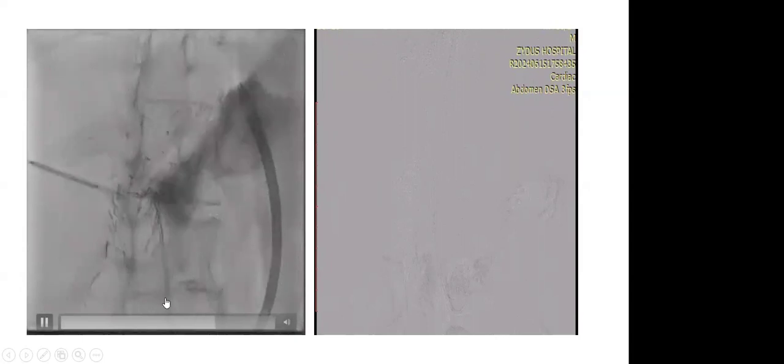This is the leak, bile leak, and our wire is there to get the support, or at least to get up to the proximal part. Now our wire, we are trying to go into the CBD. This is the biliary stent that is placed via ERCP, but they were able to put only in the anterior segment. Posterior segments were not able to cannulate. So now our wire is going inside the CBD.